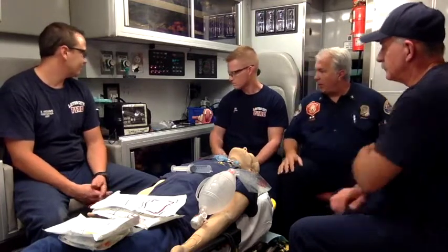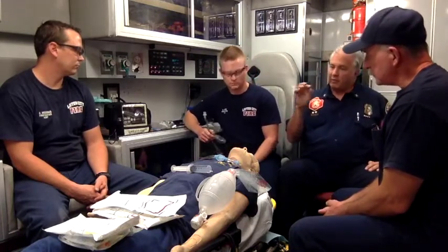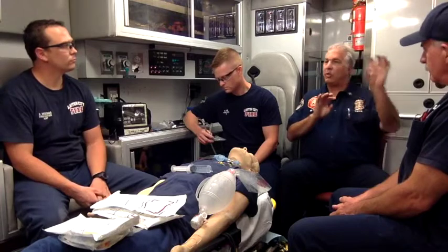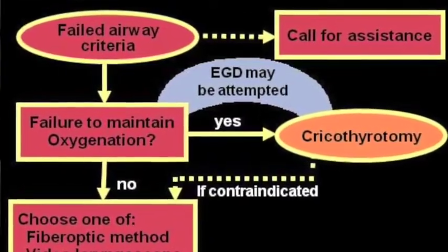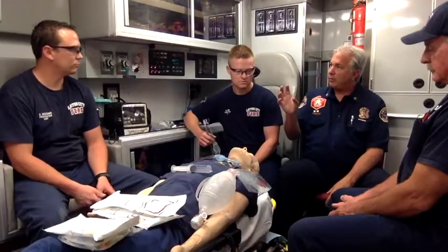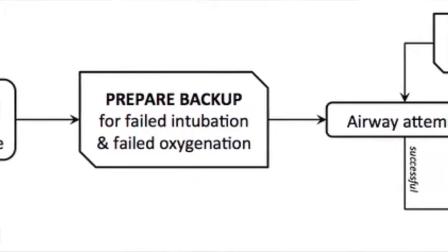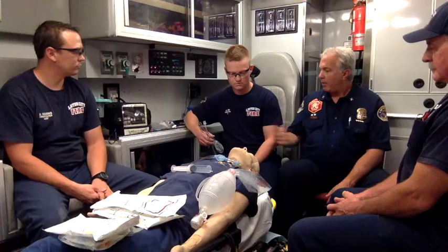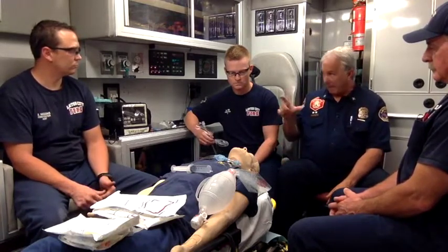But back to the ILMA, we carry that because, as I started to say, in the hospital environment the LMA and the King and all those came about because of the difficult airway course. They talked about, as we go through these airway assessments and make our airway attempts, this thing called the failed airway. So we've not been able to successfully get them intubated, and we talk about the bridge to the failed airway, which is when we cric you, okay? And in that bridge to the failed airway was an attempt of a supraglottic or EGD, extraglottic device, which is where the LMA and the ILMA really gained favor, and then pre-hospital became the LMA, the King, and the Combitube.